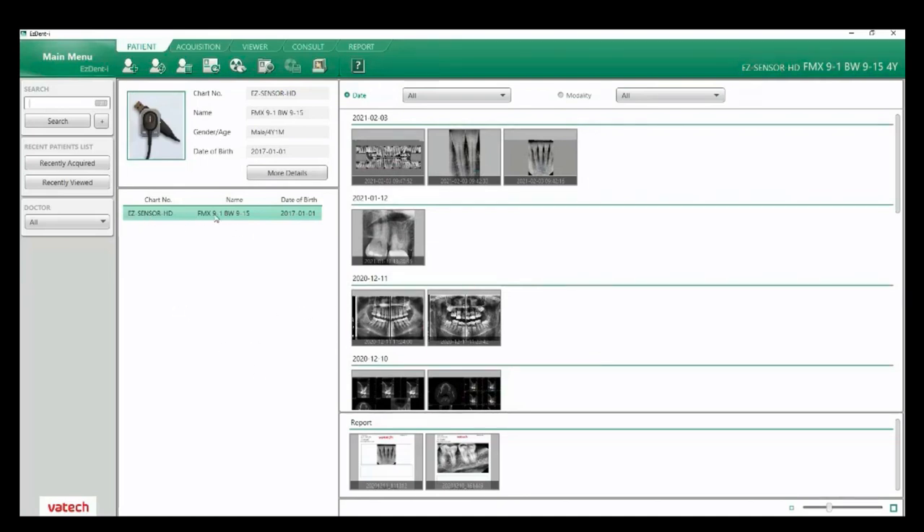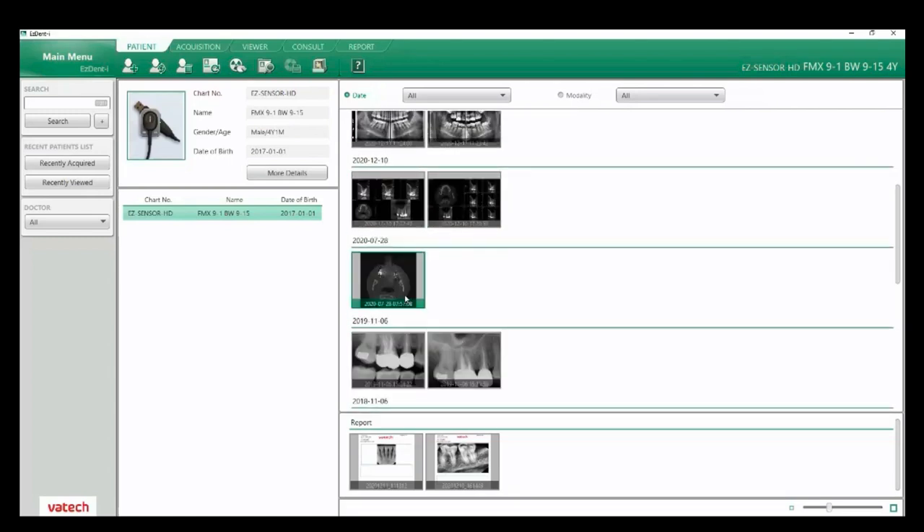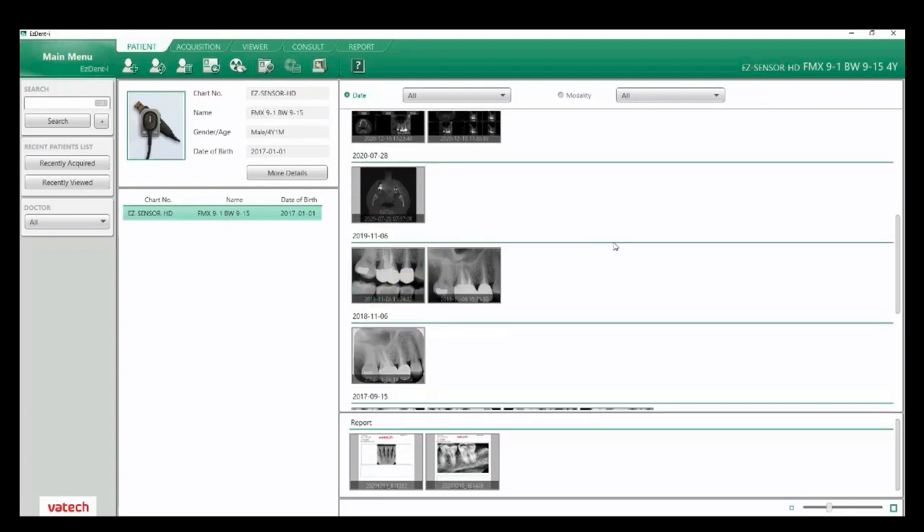Once the patient is showing, off to the right is where our images will be shown. At the top you have an option for showing by date or by modality — I have mine set to date and all. As I hover here, it shows captured images: here's an intraoral sensor, extra oral bite wings listed as a panorama, a couple other images, CBCT, and my individual shots. When I hover on these, it tells us the tooth number, modality, and the date they were taken.